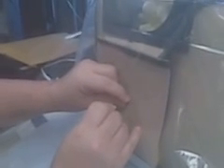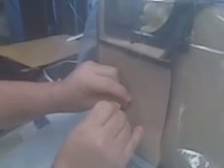Prepare my actual spinal needle. We'll go in. Meeting a little bit of resistance.